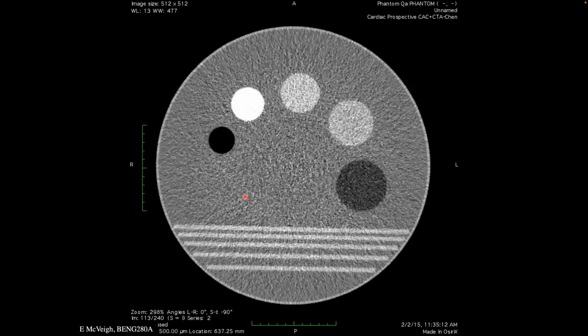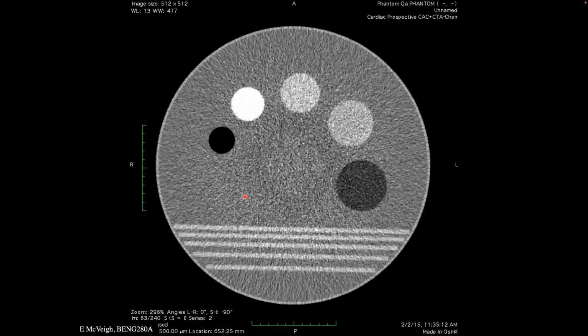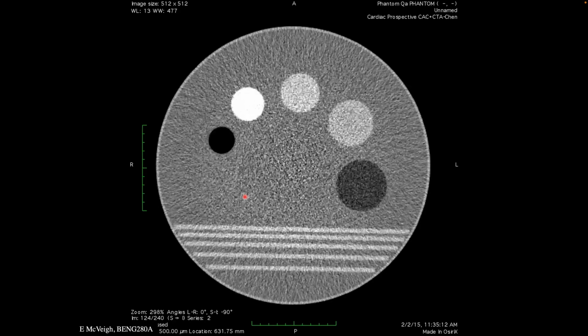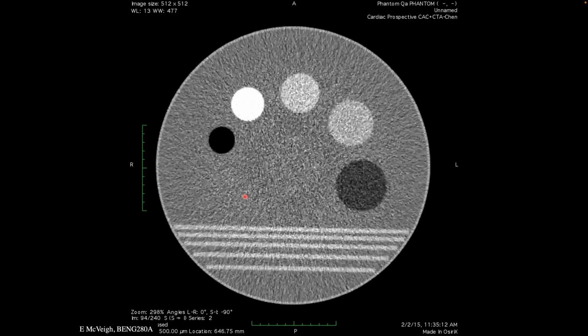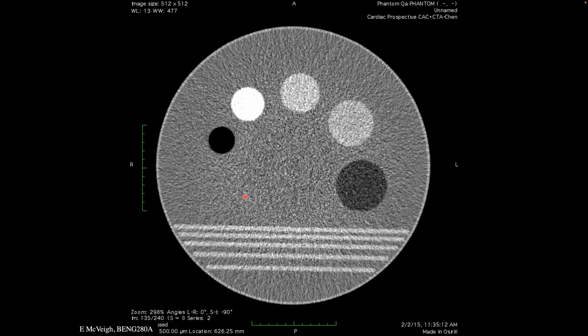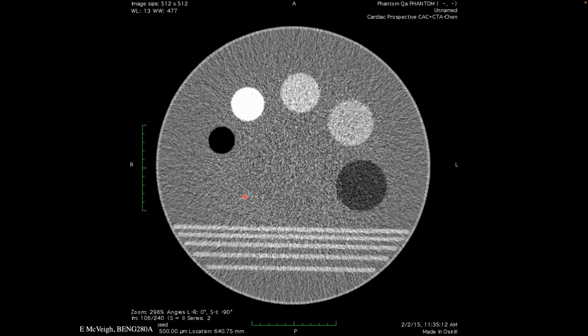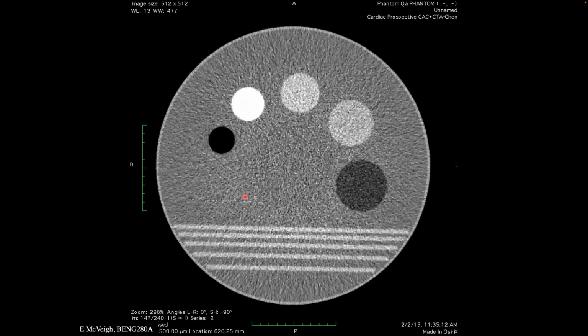And you would always reach a limit that is not scanner dependent, it's patient dependent. So you can always scan up to as much as you would want to radiate a person. That's the job of the tube designer: I'm going to give you enough X-rays, no matter what you want to do. If you want to make an image in 100 milliseconds, you will have enough X-rays to get that done. So that's usually what's done.